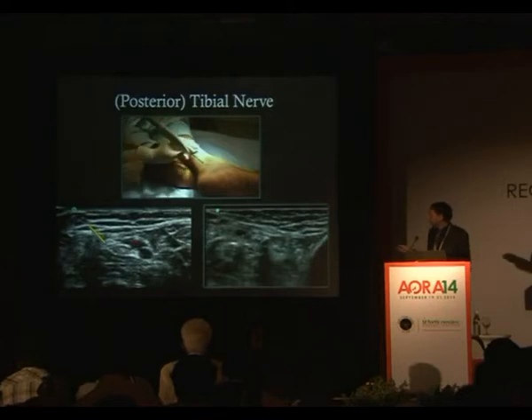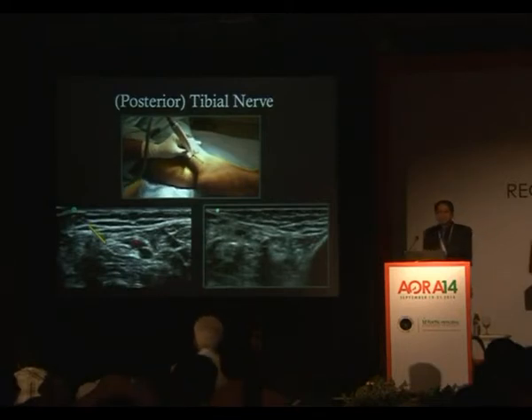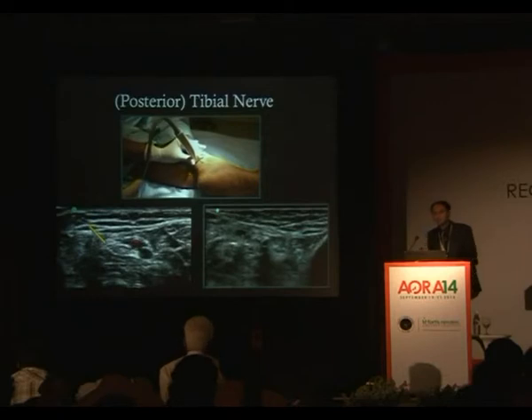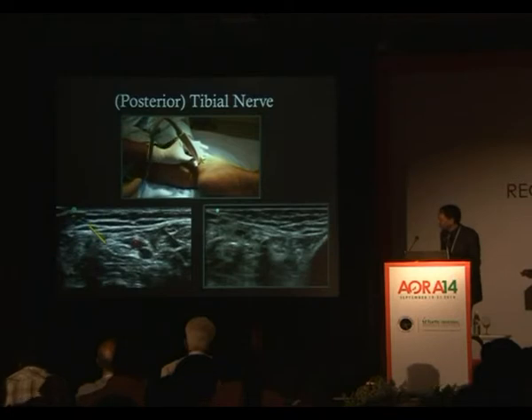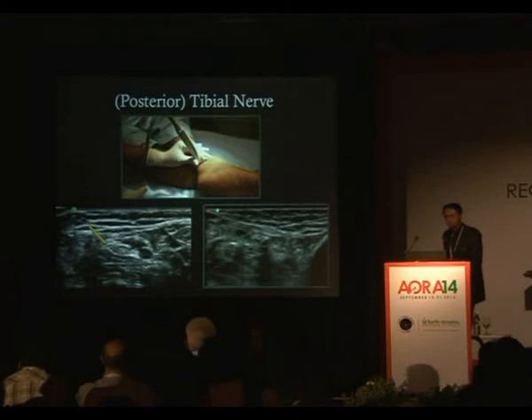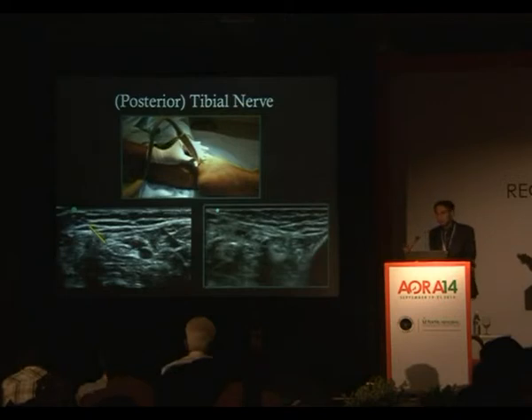Right, very quickly, like I said, we're looking behind the medial malleolus. I'm using a hockey stick probe here. And the line here indicates where the posterior tibial artery would be. I would scan at the artery, trying to identify it first, and scan up and down till I get a fairly clear picture and a fairly clear sight. So this is where the posterior tibial artery is, accompanied by a vein. And the nerve is always located close to it, either beside it or under it. It depends on where you're scanning. Right? It's very easy. This is the easiest nerve to sight because it's the largest nerve at the ankle.